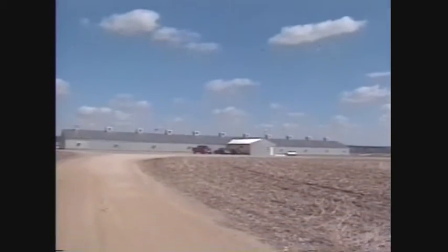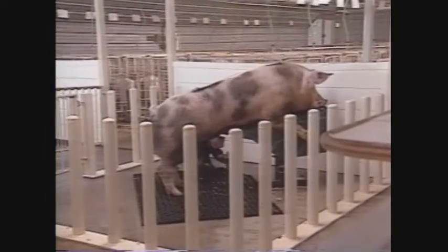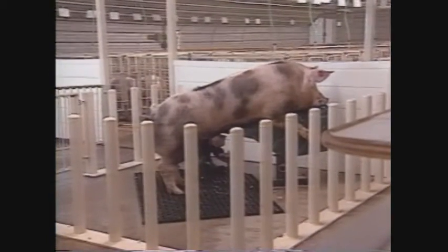Many studs avoid temperature problems by positioning the collection pens adjacent to the lab, with a warm pass-through heated to 37 degrees Celsius, providing a direct connection between the two stations. In very large studs, where this is impractical, semen can be transported via a pneumatic tube from the collection pen to the laboratory. Regardless of the semen transport system used, make sure there is good communication between the collection area and the lab.